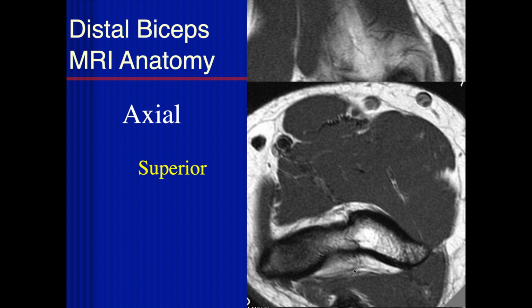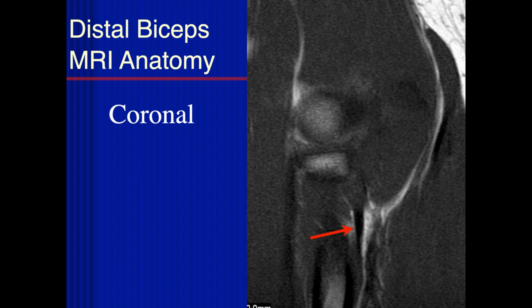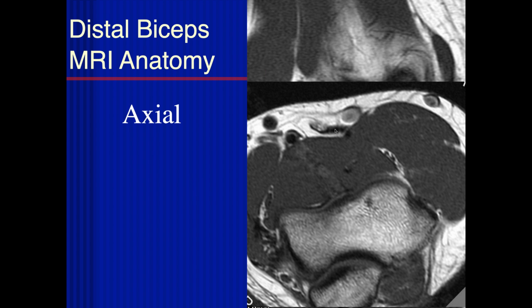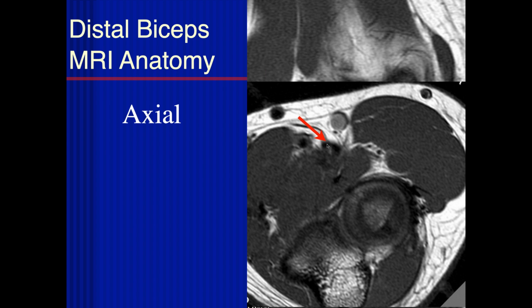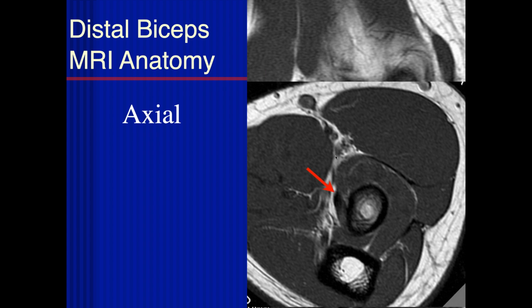So that's the coronal plane, and the axial plane is the plane that most people use to look at this, but you really should look at it on all three planes, I believe. This is the brachialis muscle, the most important one for flexion, as John just talked about. Here is the biceps more anteriorly, and you can see here the musculotendinous junction, and then we can follow it distally. There's the biceps here, and then you can actually see both heads, and this is the retinaculum coming across here to attach from the medial side. And then you can follow it all the way down here to where it attaches to the radial tuberosity.